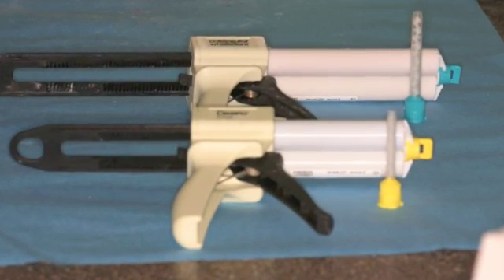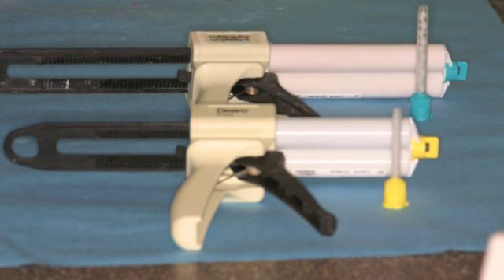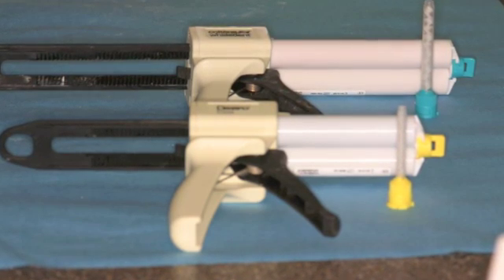Auto-mix impression guns come in two sizes. Small is for light or for medium body material. Large is used for heavy body material. And each has their own size mixing tips that are not interchangeable.